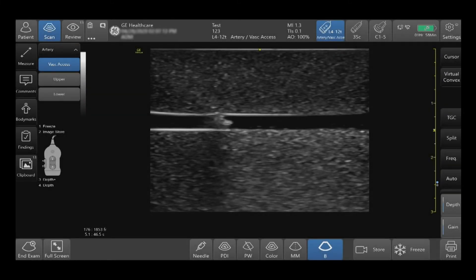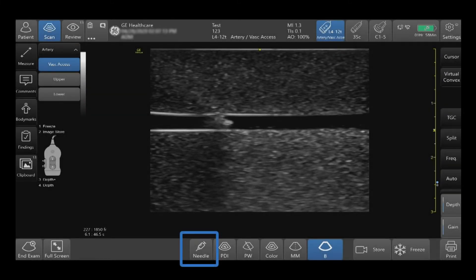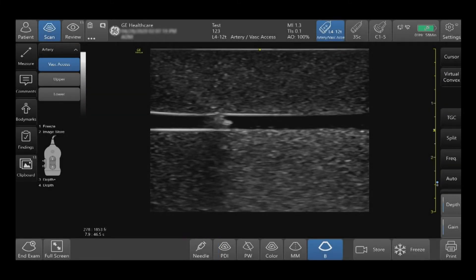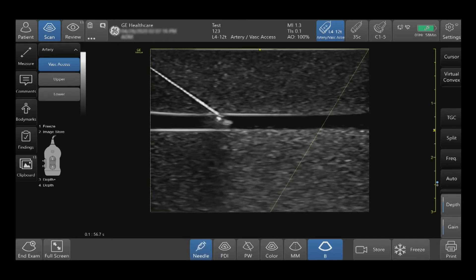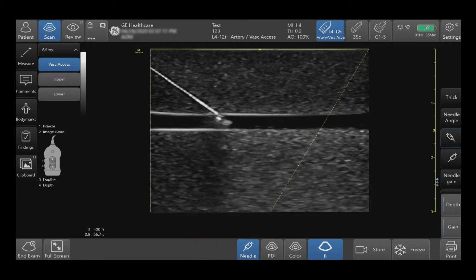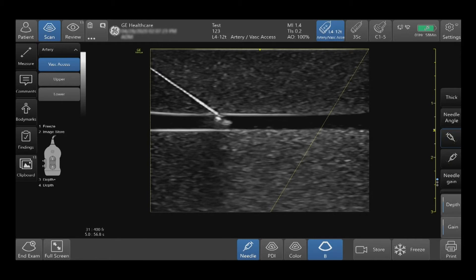To activate needle, tap needle on the bottom of your screen. The needle recognition software enhances needle visualization. Be mindful to keep the region of interest within the dotted line.